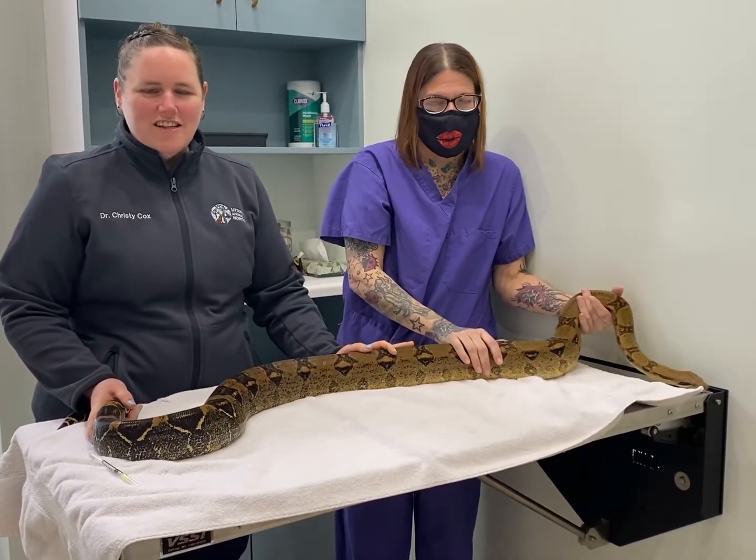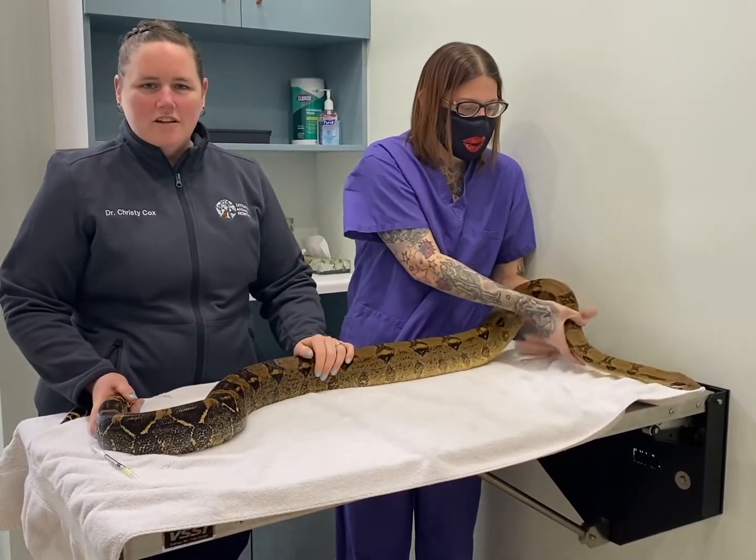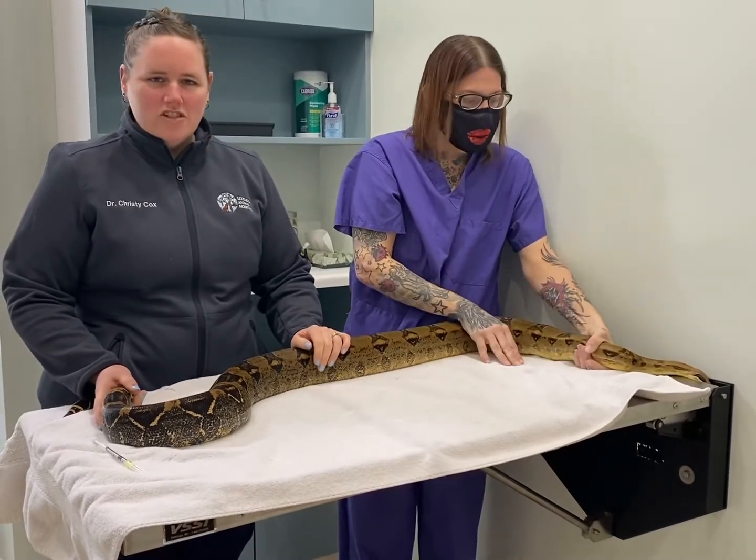Hi, I'm Dr. Christy Cox at Littleton Animal Hospital. Today we are going to learn how to give intramuscular injections into a snake.